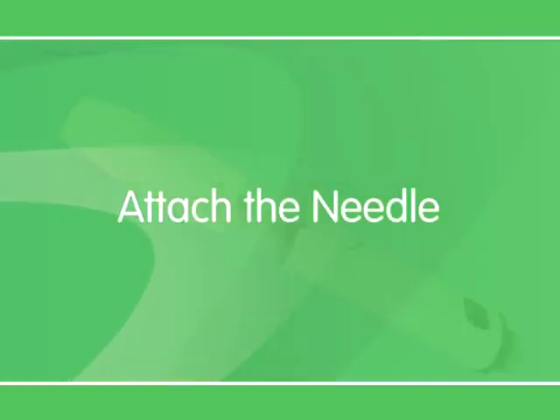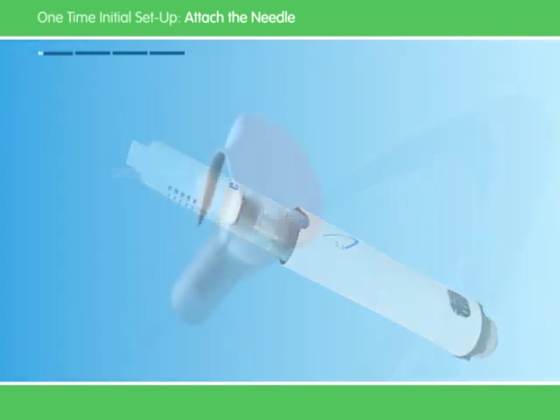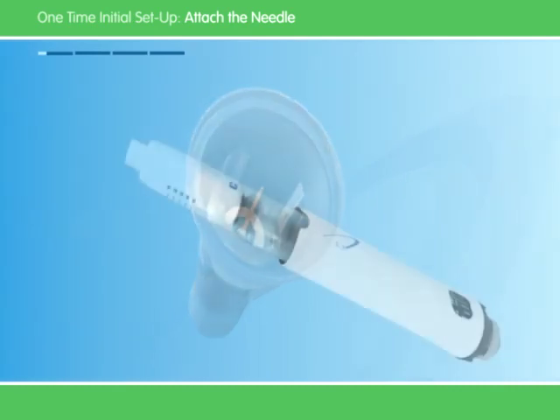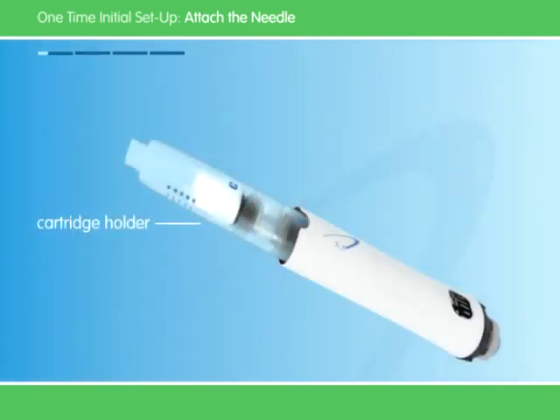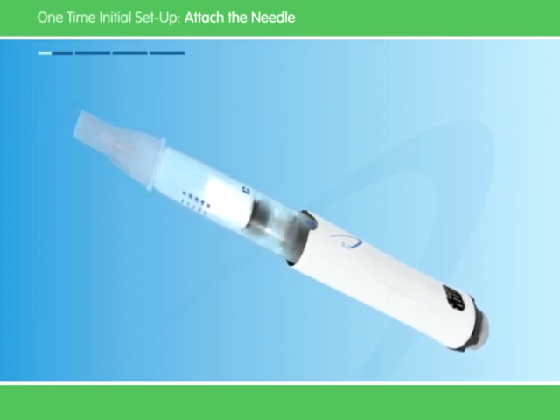Now let's proceed to put the needle on the pen. Always wash your hands before handling the Go Quick Pen and needles. First, take off the white cap. Next, pull the little tab to remove the seal on the needle. Firmly grasp the cartridge holder and push the needle onto the cartridge. Now screw the needle onto the pen and be careful not to over-tighten. Leave both needle covers on.